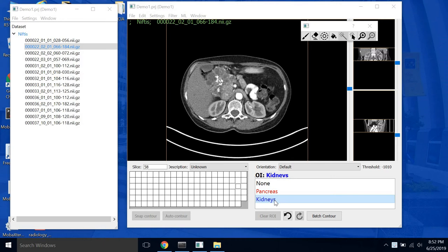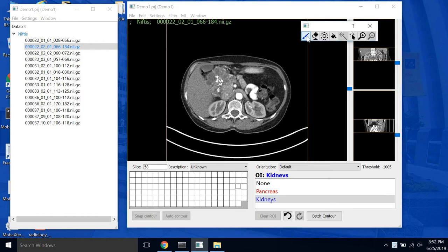So select the ROI we want to trace, in this case the kidneys. You can see that, so click the paintbrush tool here and you can see there's a little circle around our mouse.